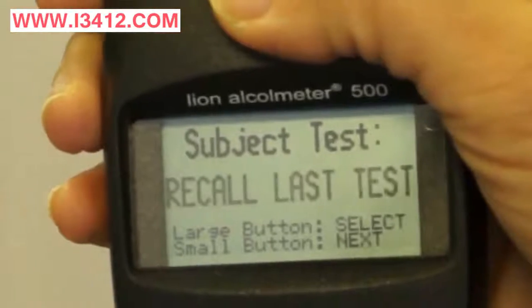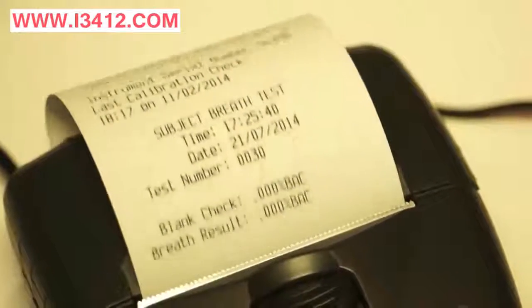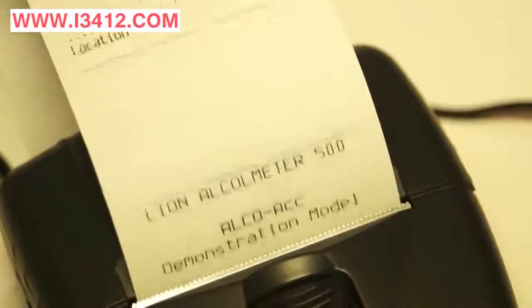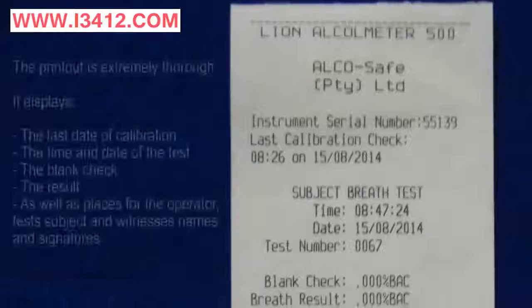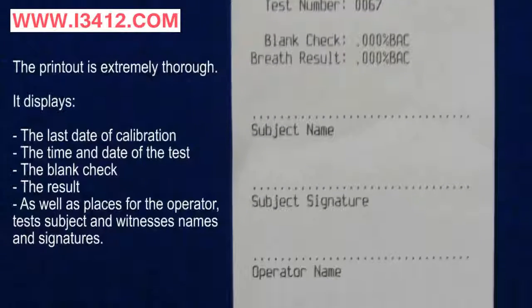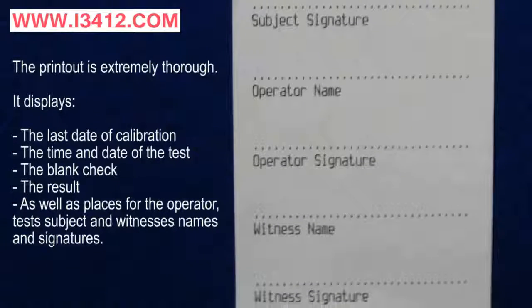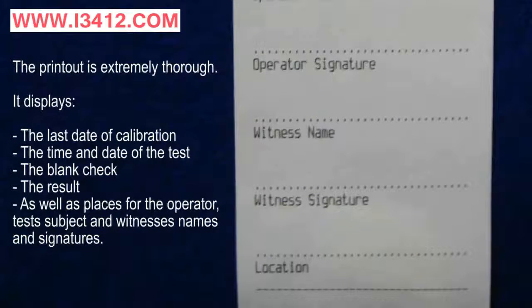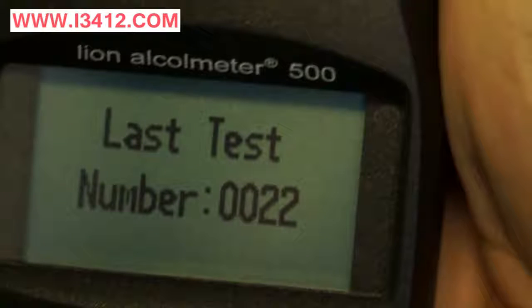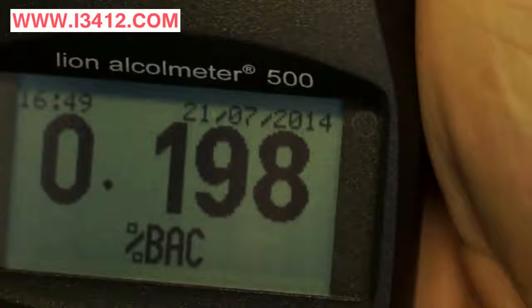Another great feature of the A500 is that it can recall the last test that was done in memory and reprint. This means that you can have as many copies of the results as you feel is necessary, or reprint if a slip is lost. It can show us the number, the date of when the test was done, the time of the test, the result, as well as if it was a pass or a fail.